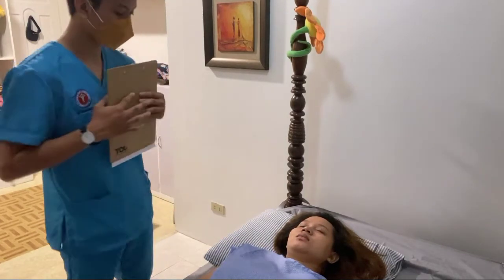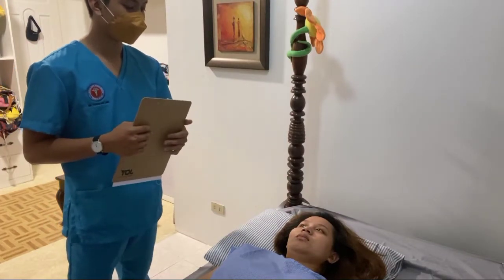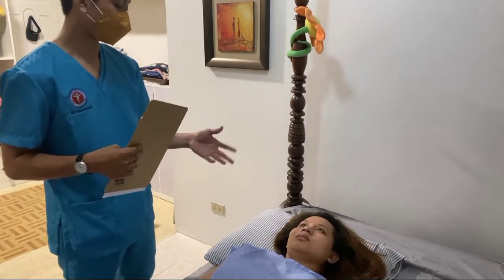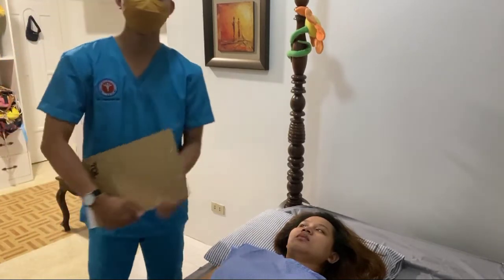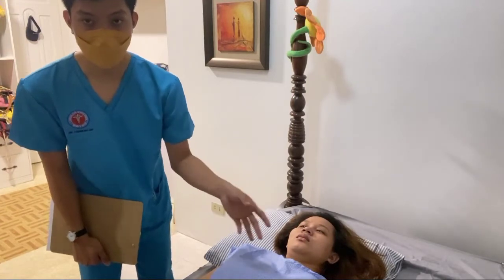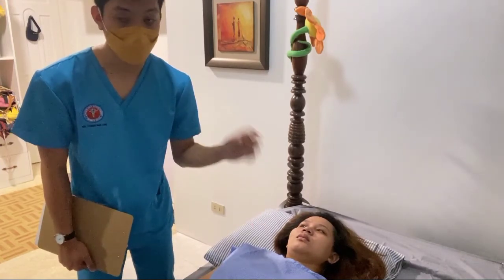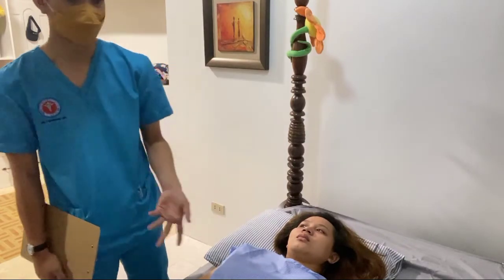We ask the patient to close her eyes, then open them. We will now assess the patient's external eye structures to see if the medication we will administer will be contraindicated or not.